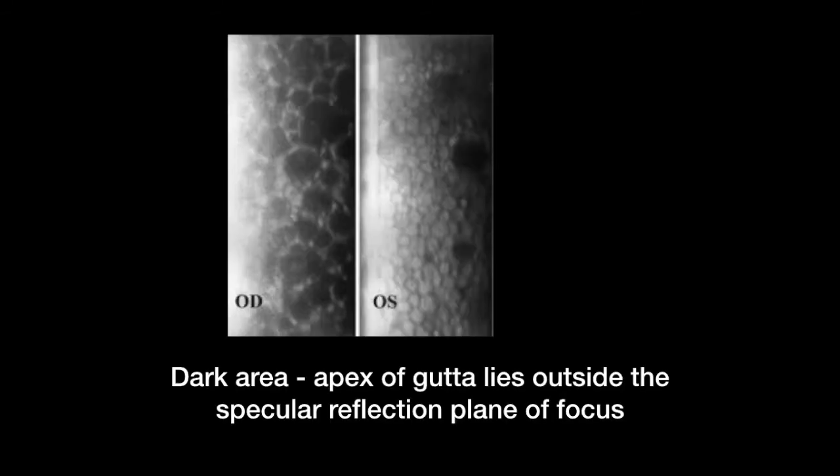When we talk about corneal guttata, they are seen as dark areas of variable sizes in the endothelial mosaic. It is very important to understand that dark areas are not because of the absence of cells, but because they protrude towards the anterior chamber. And the endothelial cells lying over the guttata don't come in the captured specular plane.